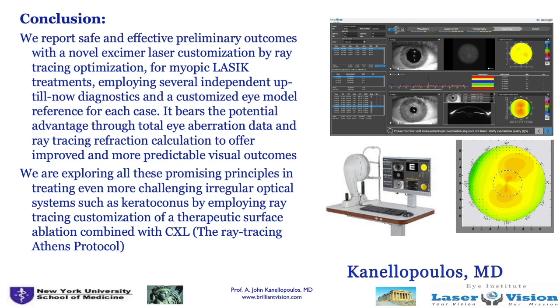Here we report safe and effective preliminary outcomes using this novel excimer laser customization by ray tracing optimization with this Alcon Wavelight platform, using a configured device by Oculus named SightMap by the manufacturer, and the treatment is called Innoveyes. It is still under study in a multi-center trial in the US and internationally, and the preliminary data from those studies are very similar.